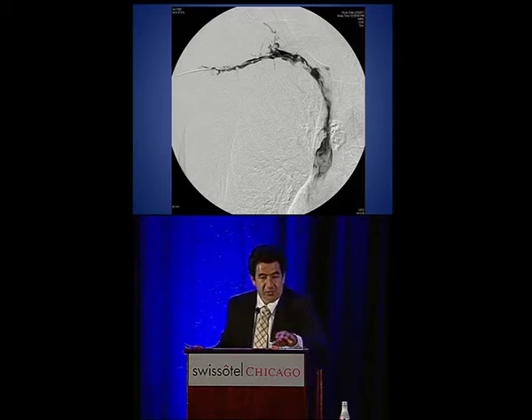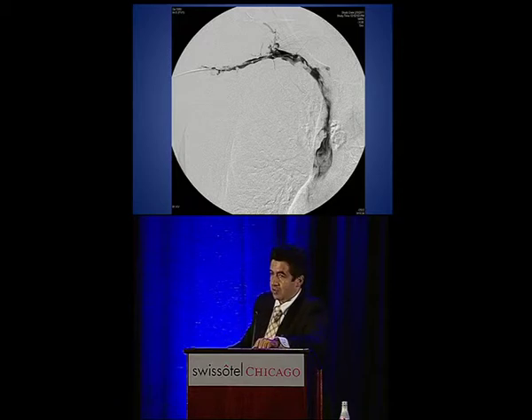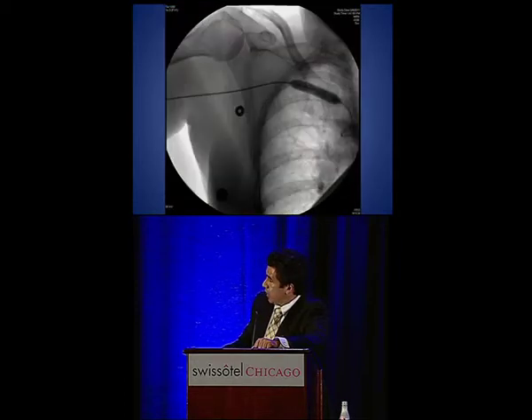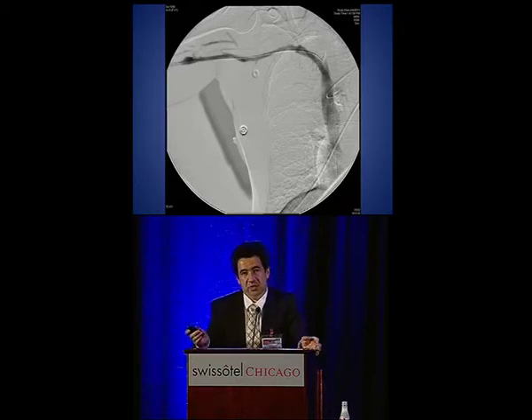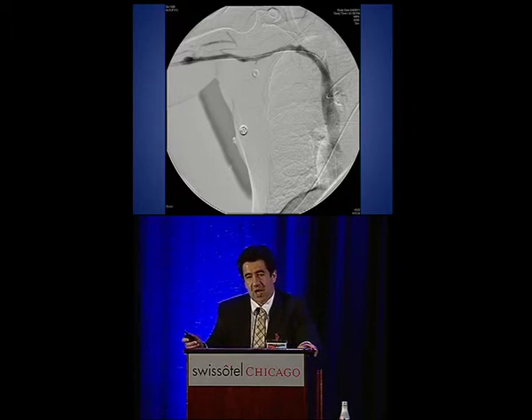I'm going to give you an example. This is a young female lawyer that I treated a few years ago, 2011. We lysed her, and then we macerated the clot and made the angiogram look really pretty. And then I sat with her, and I gave her all this information and all these different approaches. Smart lawyer, and she said, you know what, I really don't want to have surgery. Let's take a chance. Well, as long as you know that you have a 30% chance of needing the surgery, I'm okay with it. She decided not to have surgery.